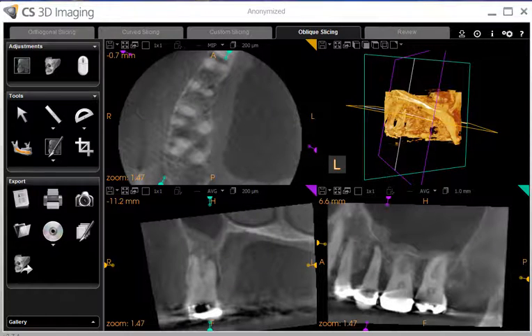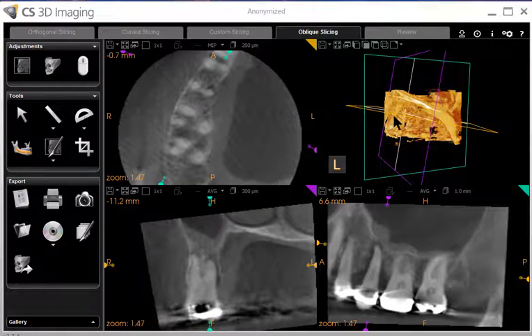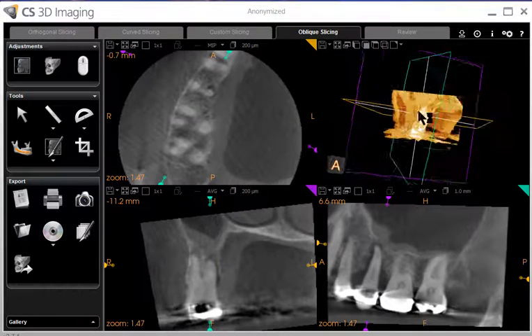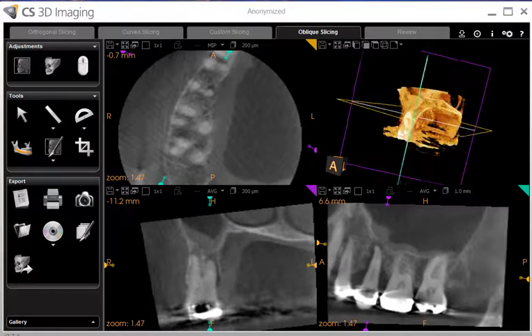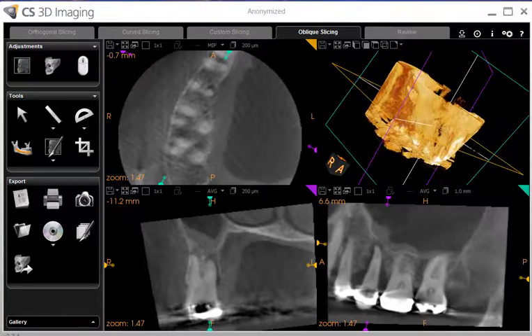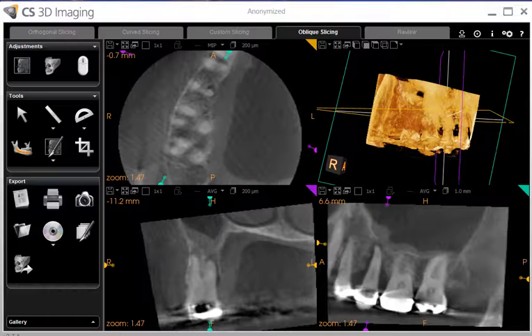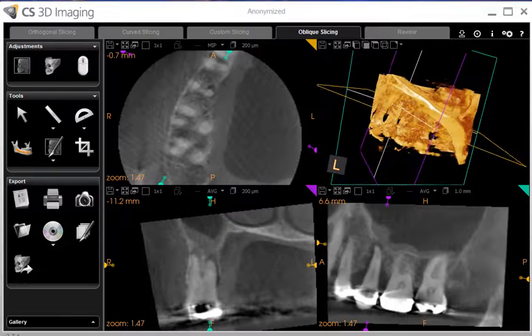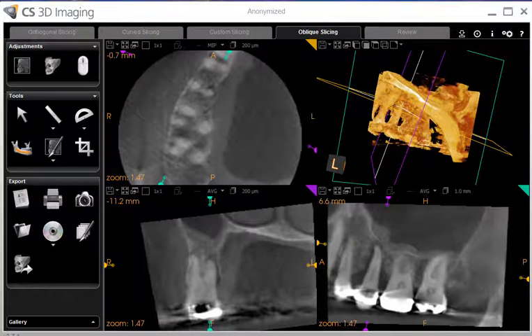This is a typical 3D small volume scan taken at 200 microns — that's the minimum width of the slices. There was quite a bit of metal restoration causing some beam hardening, so the 3D part is usually not all that diagnostic. You can use it to orient yourself; for example, we're looking at the first and second bicuspid area and the hard palate.